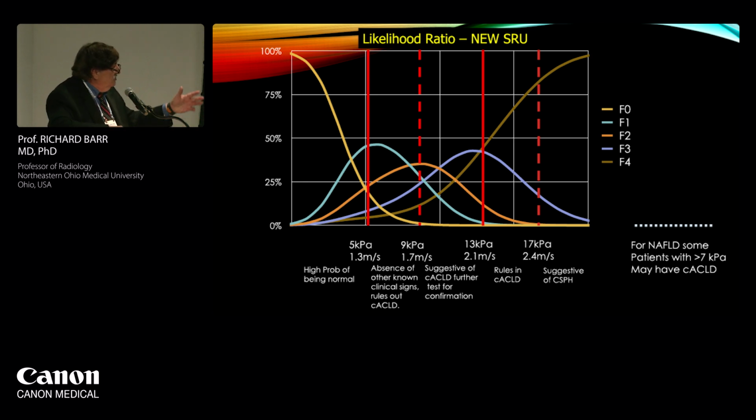So if we look back at that table, we now have redesigned things. We kept 5 kPa, below which you have no or mild fibrosis. We moved the high cutoff value from 15 to 13 because I think we now realize that people that had F3 disease actually are at risk for all the complications of chronic liver disease, so we wanted to not miss them. So we moved that down, and then we split the difference between the 5 and 13 at 9.